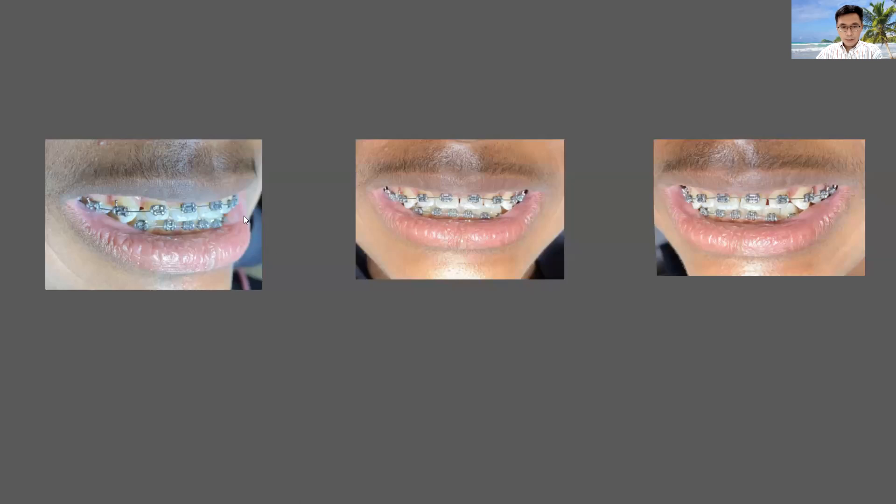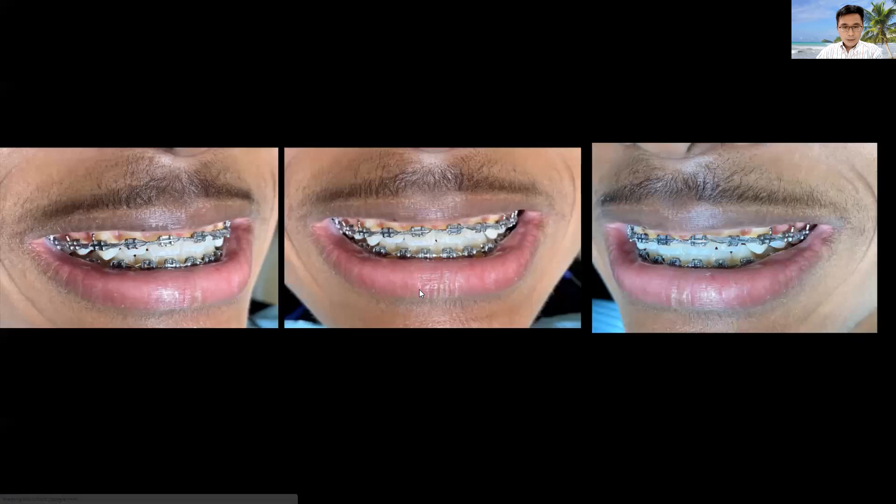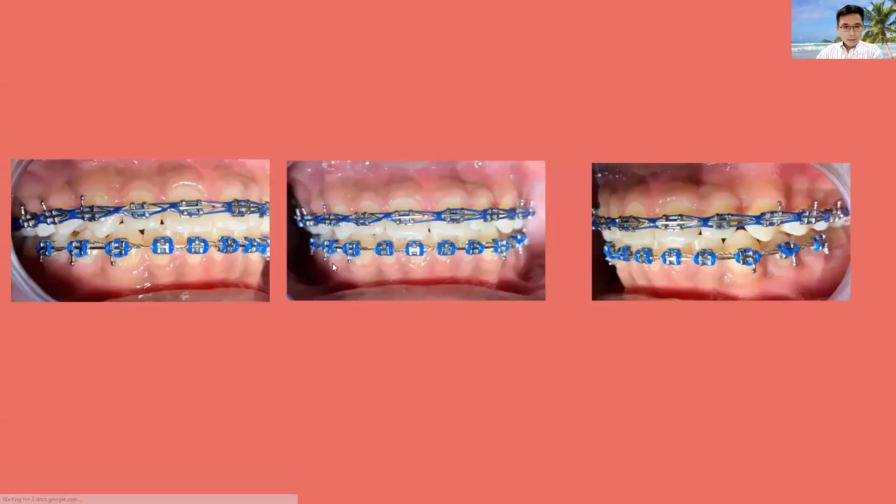We start with NiTi wire upper and lower to slowly unravel any crowded or crooked teeth. Each month things will be shifting. Within a couple of months you can see that when smiling, the patient can bite together instead of having open bite on the back teeth. We then progress to a standard stainless steel archwire with maximum torque and close the spaces, all taking place at the same time. You can see the gap there — if you're patient enough, you'll be able to close it.